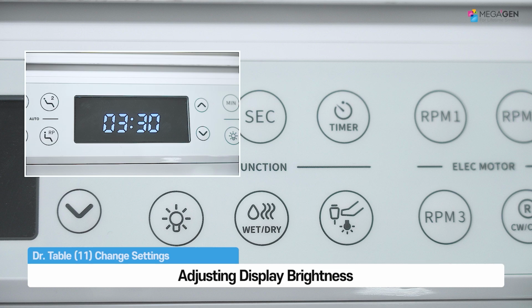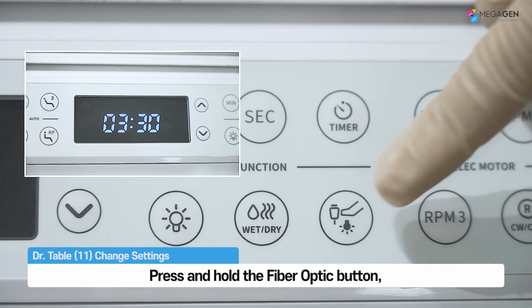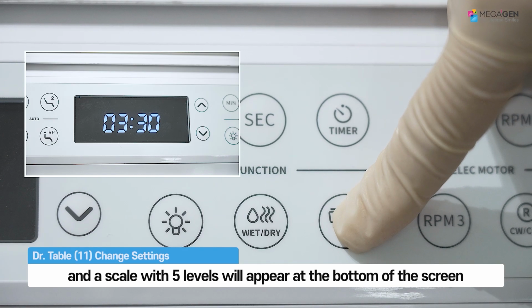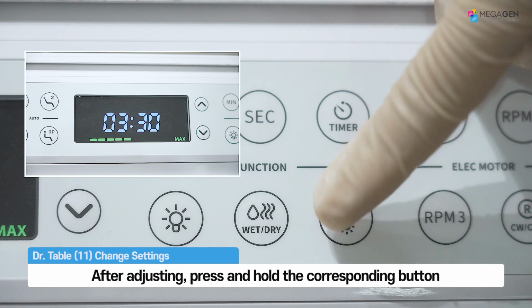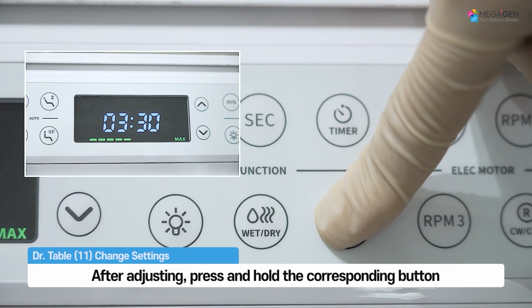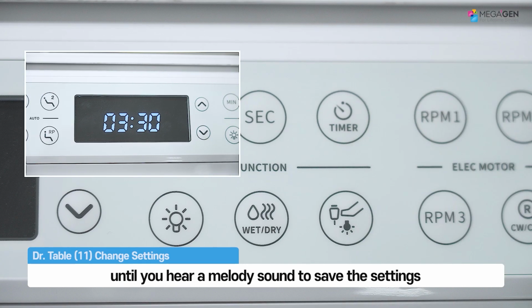Adjusting display brightness. Press and hold the fiber optic button, and a scale with 5 levels will appear at the bottom of the screen. Use the arrow keys to adjust the screen brightness. After adjusting, press and hold the corresponding button until you hear a melody sound to save the settings.